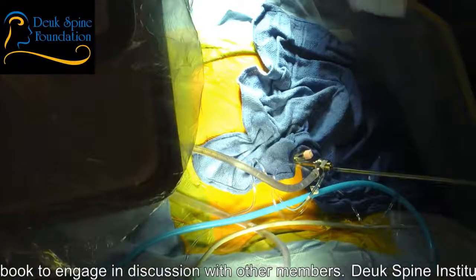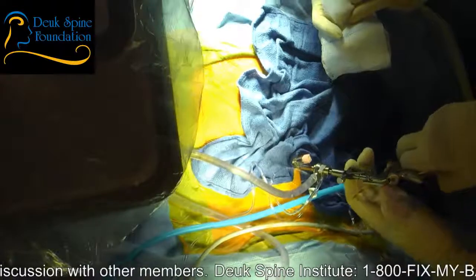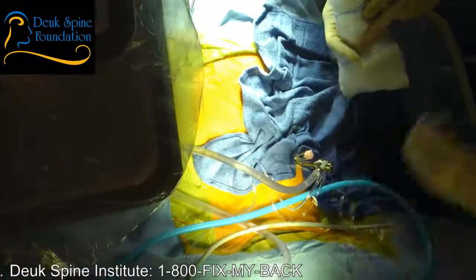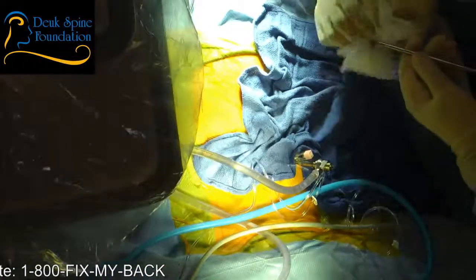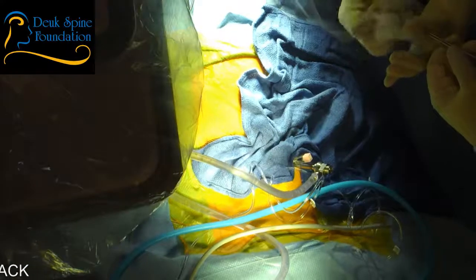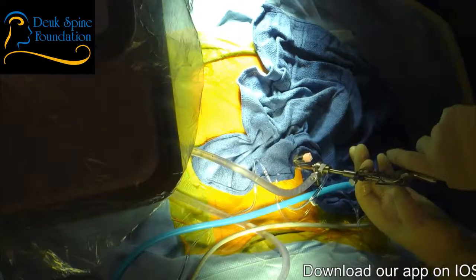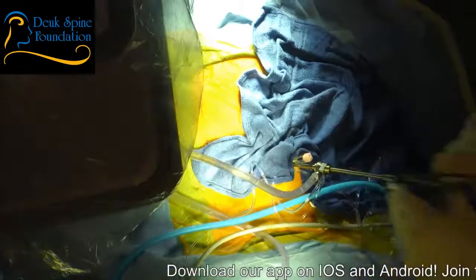Anything? There's a nice chunk. I don't want to put chunks back. The key is to shove in a piece of the towel and then pull the whole thing out nice and easy. You understand? You understand the words that are coming out of my mouth?